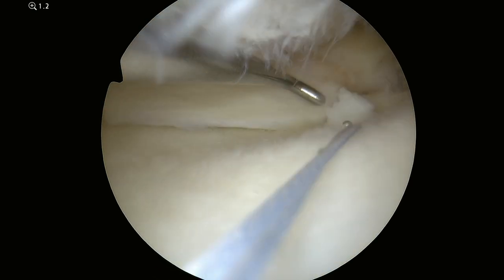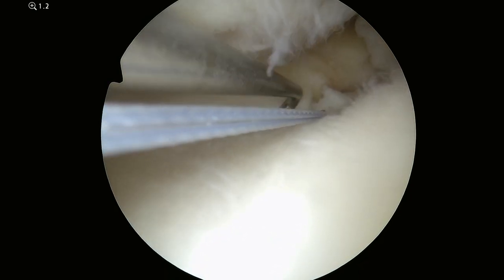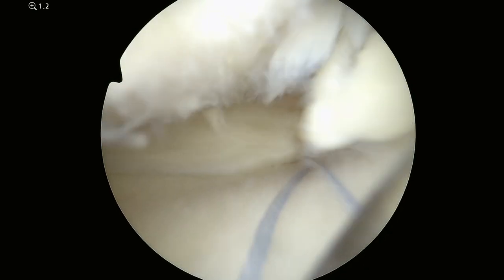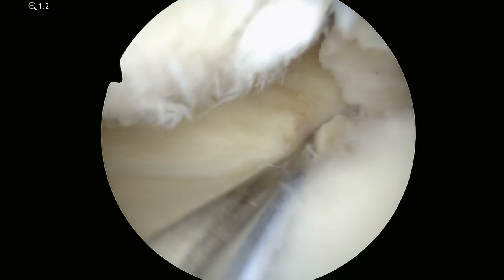This is a video of a medial meniscal posterior root repair. This is the meniscus and I'm probing where the tear is. This should be connected to the little stub of tissue to the right. I've already drilled a tunnel and passed these blue stitches that I'm going to use for the repair.